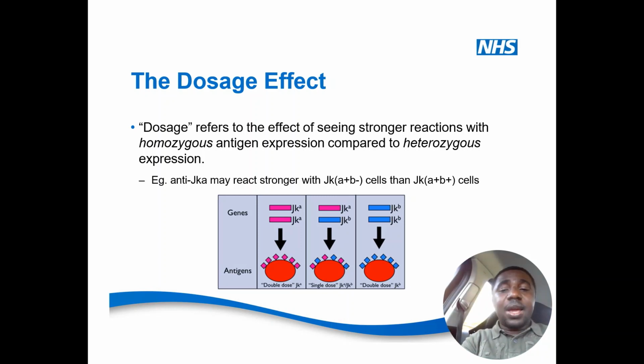So you have JKA, you have JKB. They are from the same family of antibody. So what happens is sometimes, there can be competition of them trying to bind to a particular site, and that can affect the level of the reaction. Let me explain it this way, okay? So that this can be very more helpful.